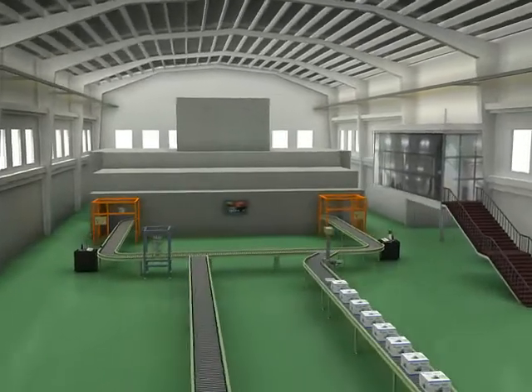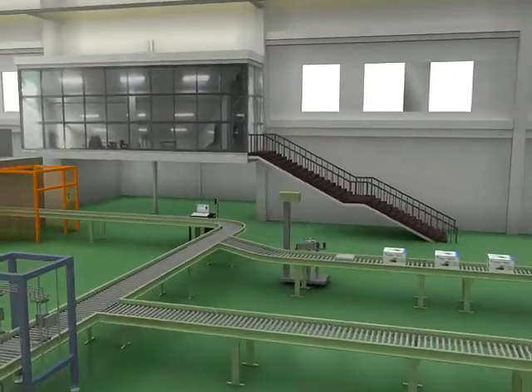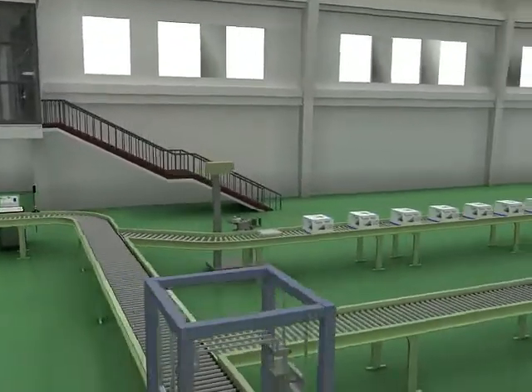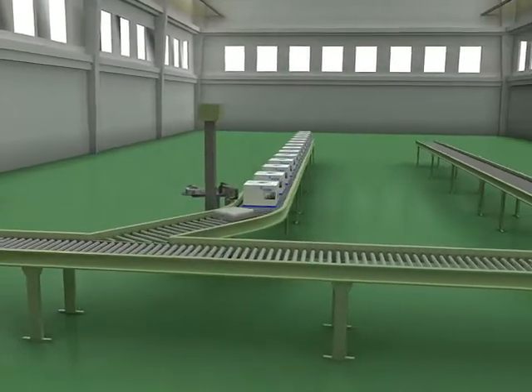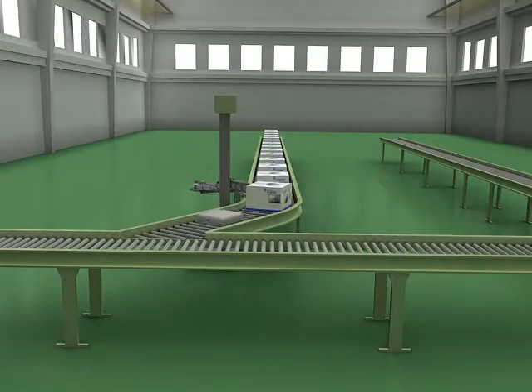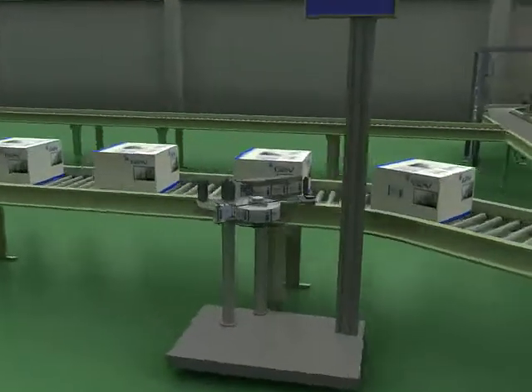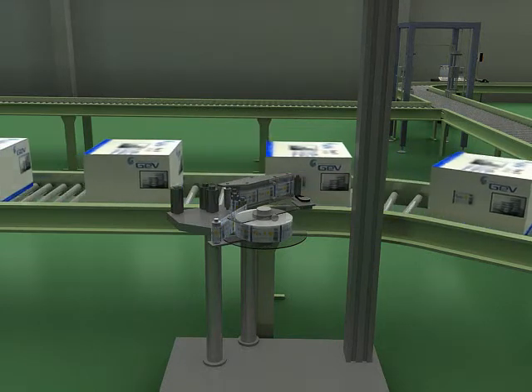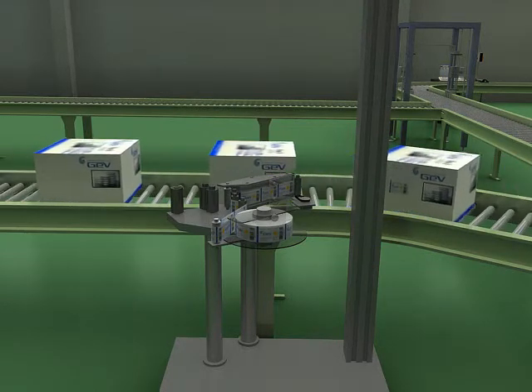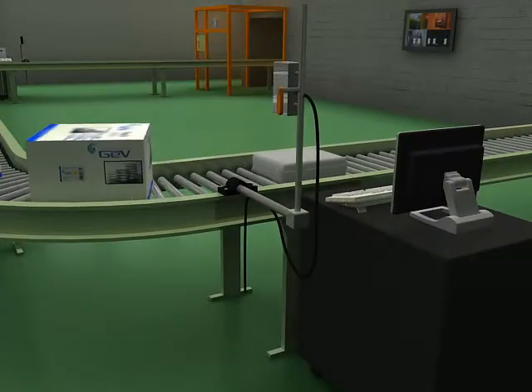The product is transferred from the non-sterile zone to the in-feed zone for electron beam irradiation. At this time, the products are conveyed one by one into the bunker, led by a polystyrene phantom including a film dosimeter. Moreover, an automatic labeling device gives each product its own barcode. At the same time, a radiation indicator is attached for distinguishing which products have undergone electron beam irradiation.